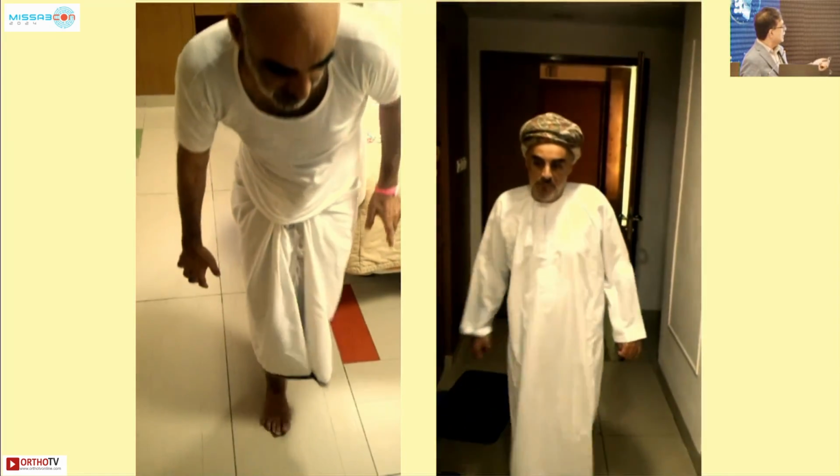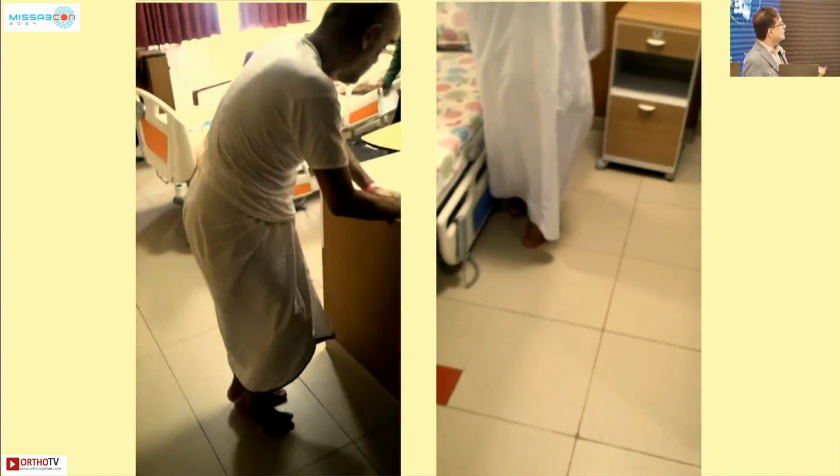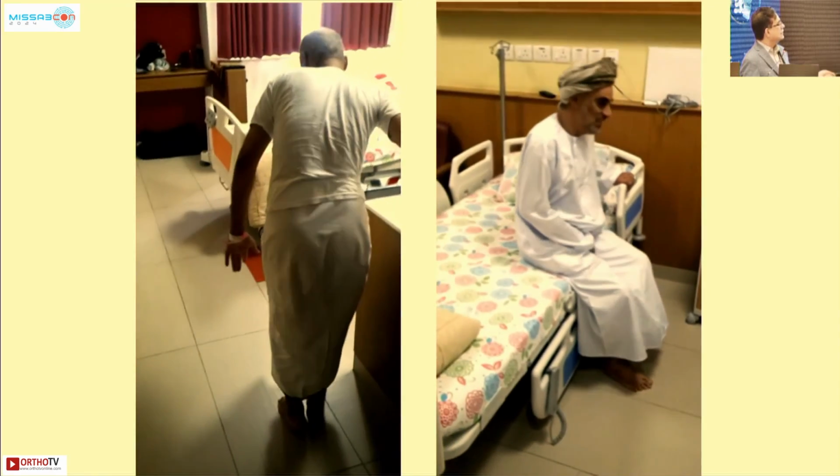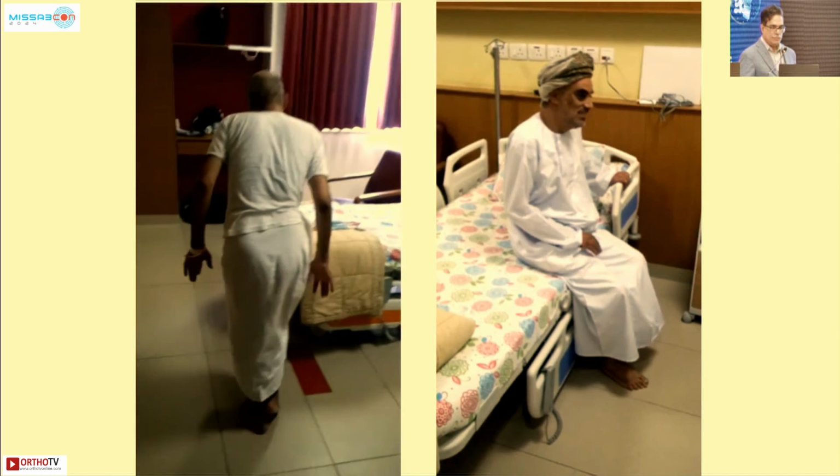So this is a gentleman with cervical spondylotic myelopathy who's undergone a fixation, who has residual spasticity, and this is him coming for the first refill about 6 to 9 months after the procedure.